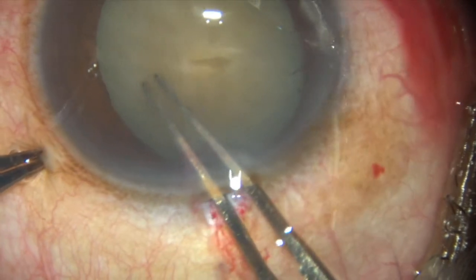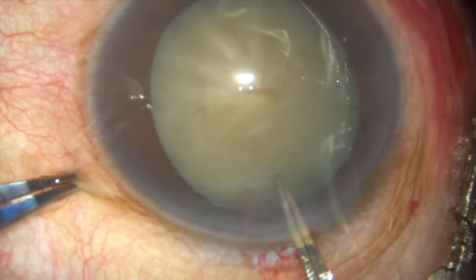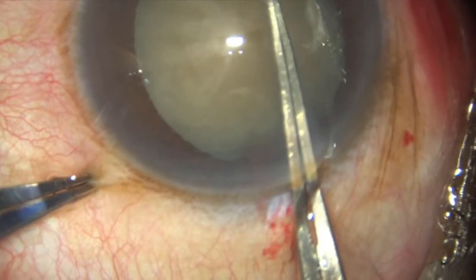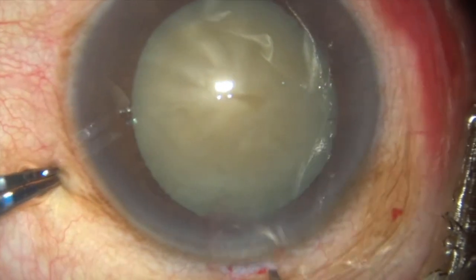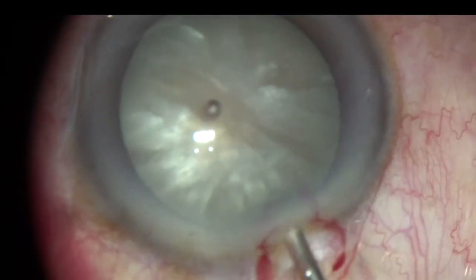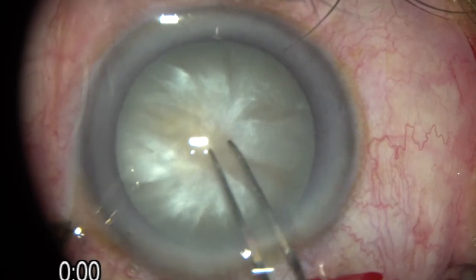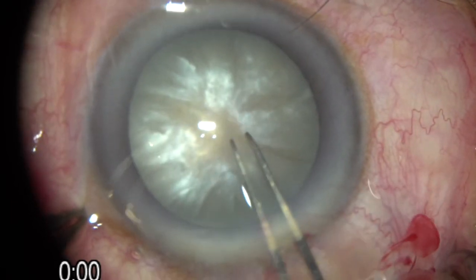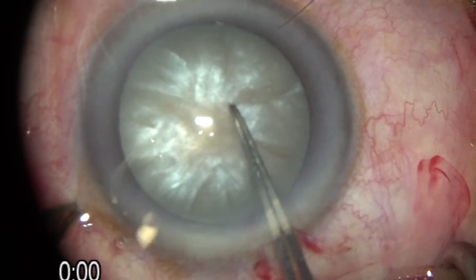This technique does not require surgeons to acquire any additional skill or equipment. It is simple and reproducible. Start with the regular main phaco incision as always. Fill the anterior chamber adequately with OVD. It is important not to overfill the anterior chamber in this technique, as you need space for the liquefied cortex to regress out of the anterior chamber.